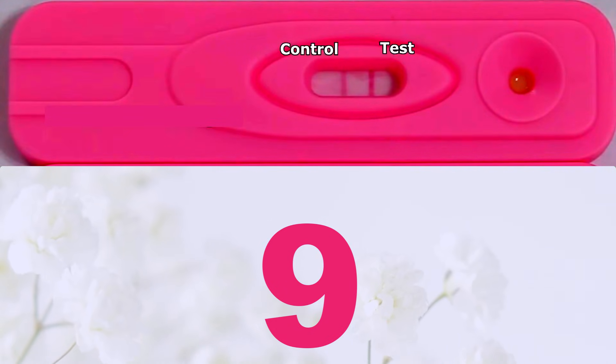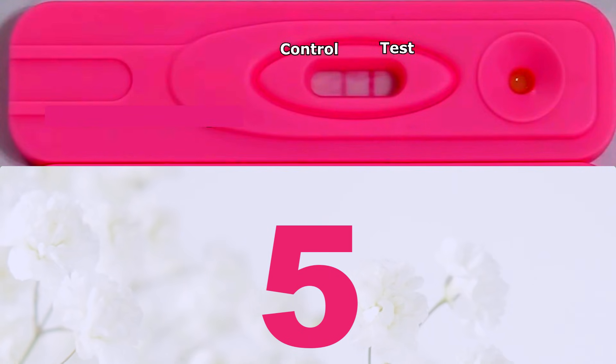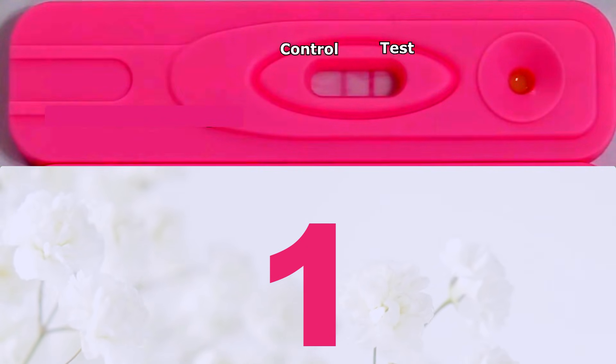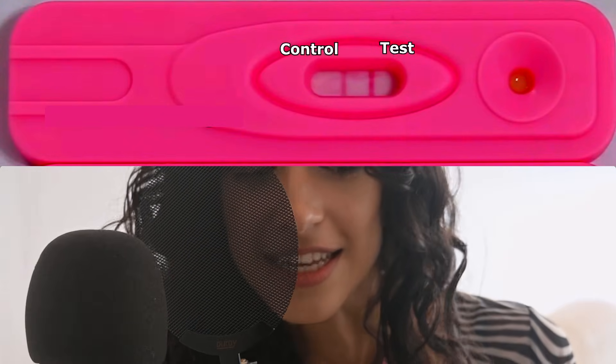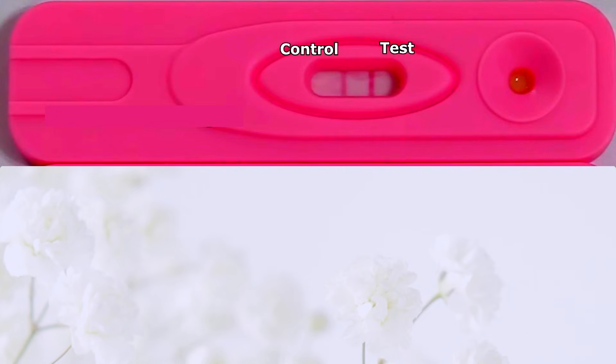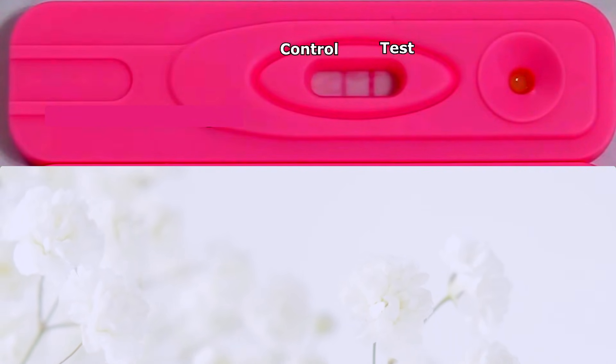Why is timing so important? The earlier you test, the weaker the signal will be. For example, on day 1 after missing your period, the signal might be too small to detect. By week 1 after missing your period, the signal is much stronger, so the test is more likely to be accurate. That's why waiting a little longer can save you from unnecessary stress.